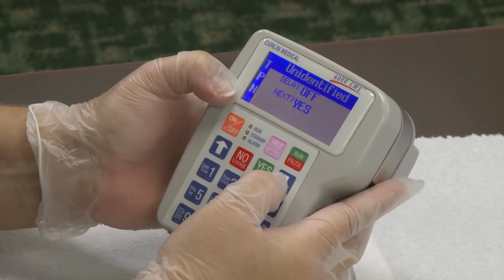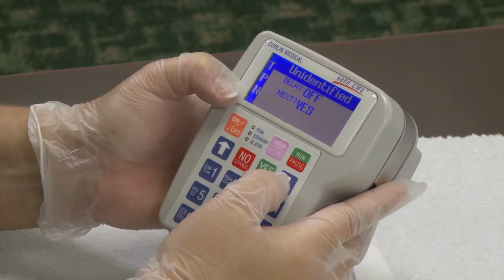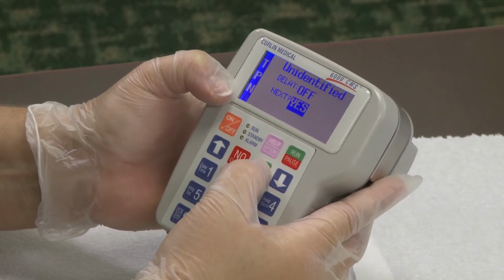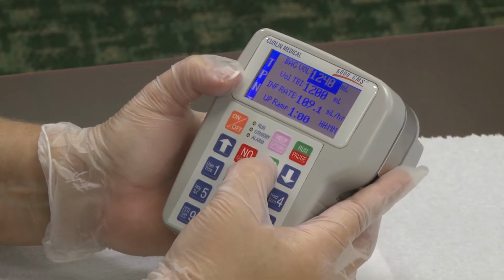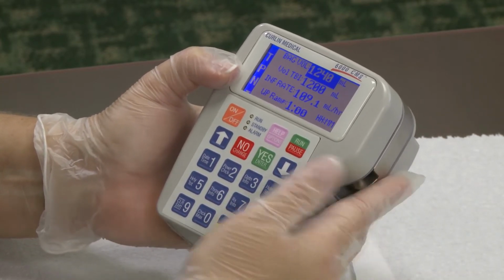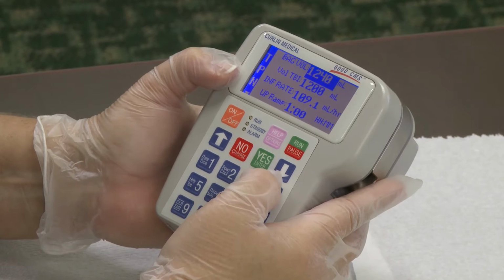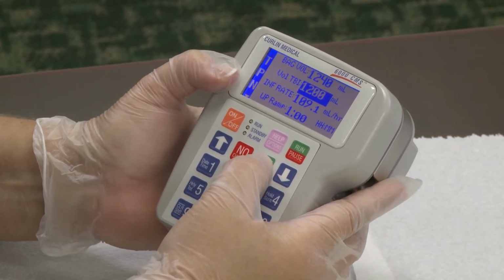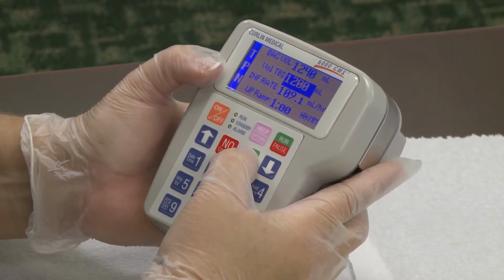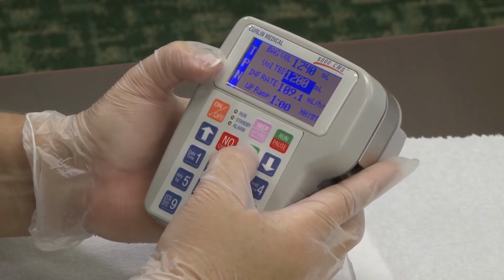So unidentified comes up first. We can sometimes put a patient name in here, and that's what this is for, but we're going to leave it as unidentified and say yes. Delay is off. Next is yes. Bag volume, 1,240 milliliters is what we're going to have this program for, and that's the amount in your TPN bag, as opposed to the next thing, which says vol TBI, volume to be infused. So once I say yes to bag volume, it comes down to that. You're only going to give yourself 1,200. The extra 40 is going to be at the end in case you need it to run for a little while till you're ready to finish and flush.